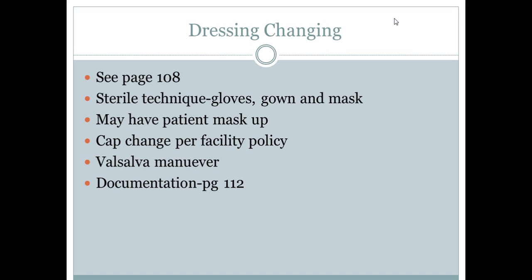So we've got to put a cap on it to close it off. Generally, the caps are changed when the dressing changes are done. Also, it is done if it gets bloody. If you have a nurse that is accessing it frequently for blood draws, you might have some blood that ends up in the cap. So it is a good idea, and some places do have a policy that says after blood draws that you change the cap.